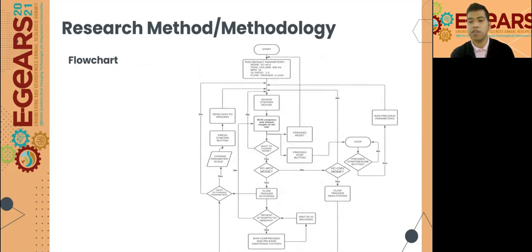This flowchart shows the sequential operation in controlling the ventilator. As the start button is pressed, the ventilator will operate in the default parameters in VC-ACV mode. Then the stepper motor will rotate, causing the presser to compress the ambu bag. The user can also change the mode of operation, either VC-ACV or assist control, and VC-CMV for the continuous mandatory control, as well as the parameters.